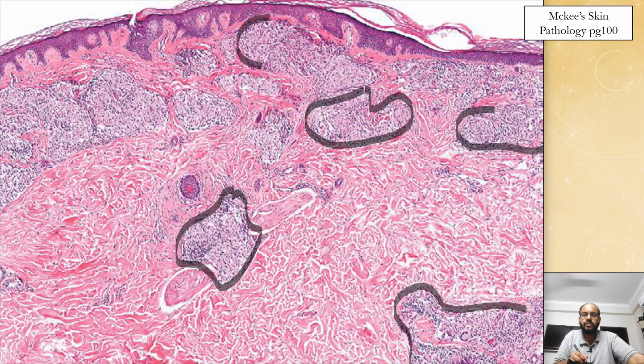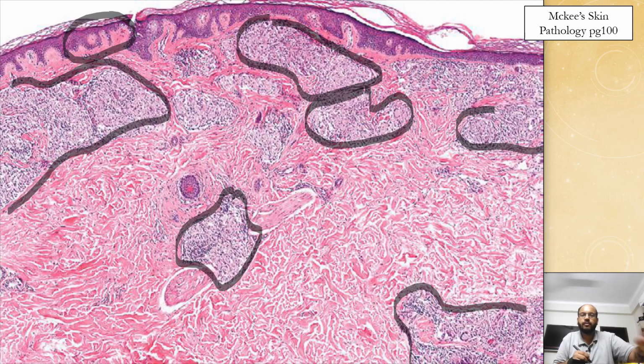and these are very large granulomas, and they are sparing the papillary dermis. Here is the papillary dermis, and that is spared. These are granulomas, and they don't have that lymphocytic rim or the background lymphocytes. So that is why they are known as naked granulomas.